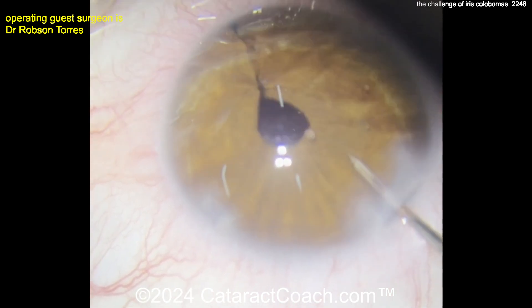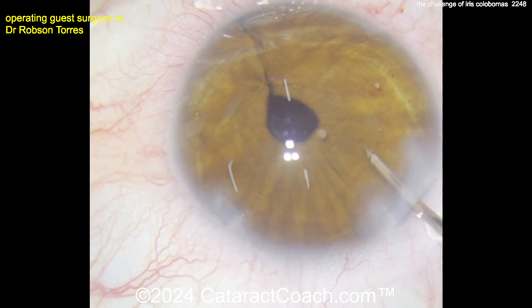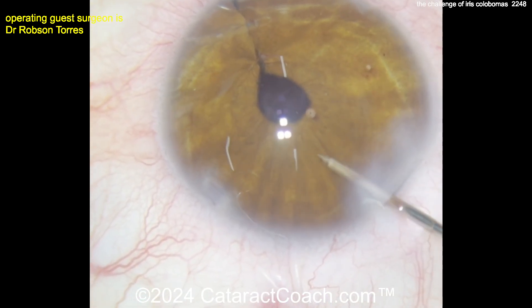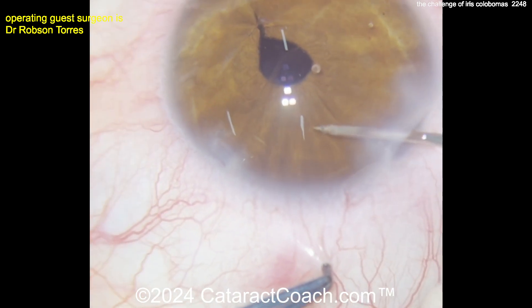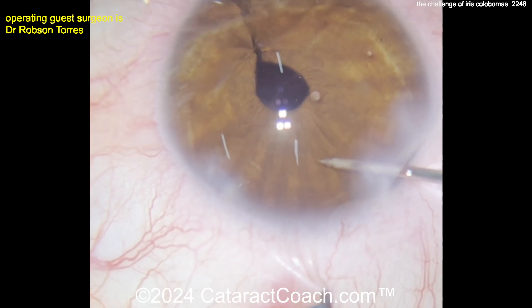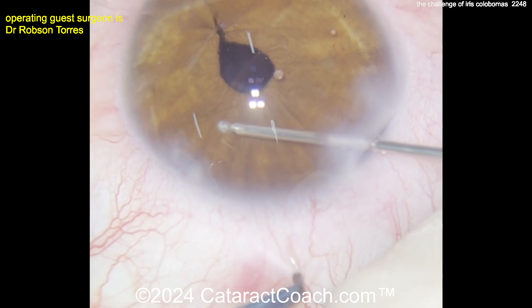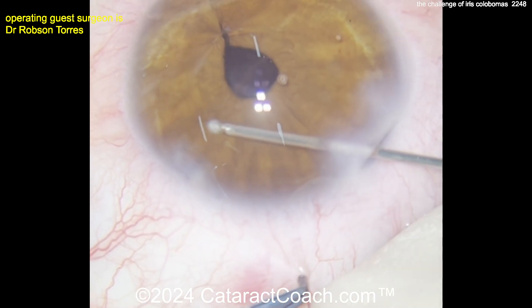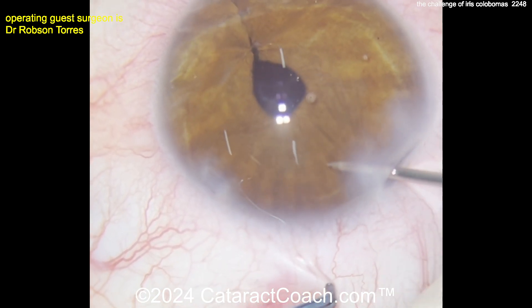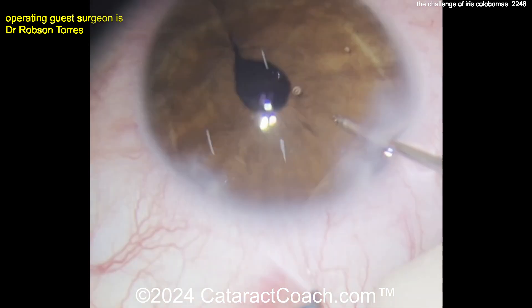You can shrink the iris and pull the pupil back into a better position. Using the tip of the endocautery in the iris stroma, you can actually contract it and shift the pupil to get it much better centered. Going all around with little bits of endocautery. You can also use higher energy for more contraction, but the key is to be pretty gentle. At the end, you'll have a really nice result.